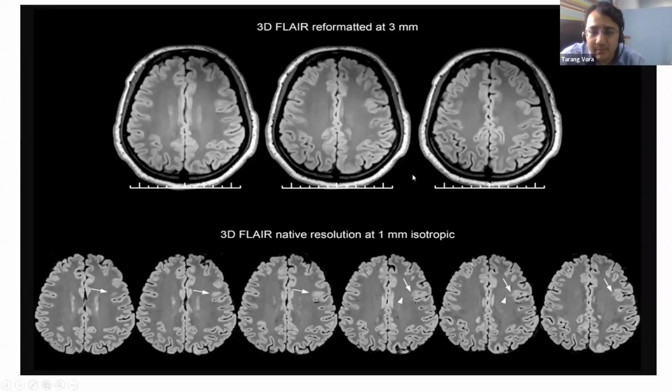When we reformat the images, we want to reformat them in the same 1 millimeter isotropic reformatting. If we reformat the 3D images in a 3 millimeter gap slice, we may miss the dysplasia. So it's necessary that the slices are very, very thin or have no gaps at all. It has to be a high quality 3D MRI.